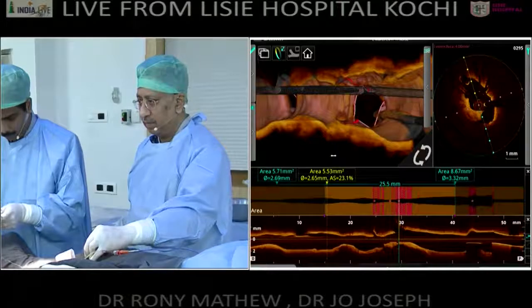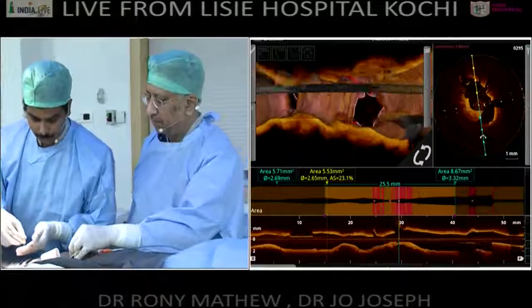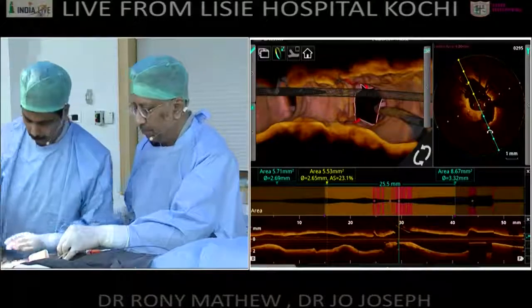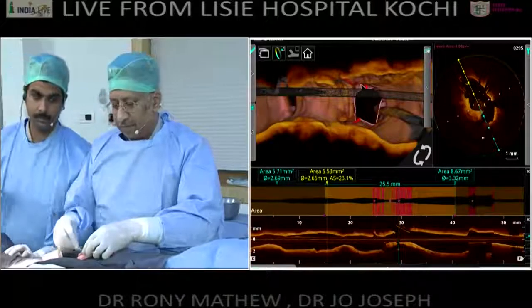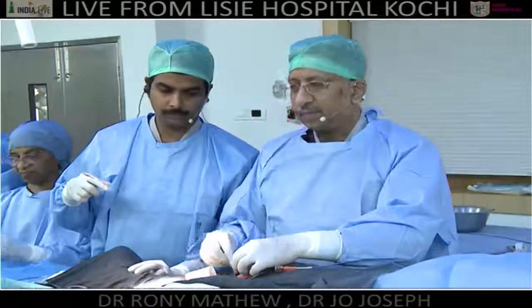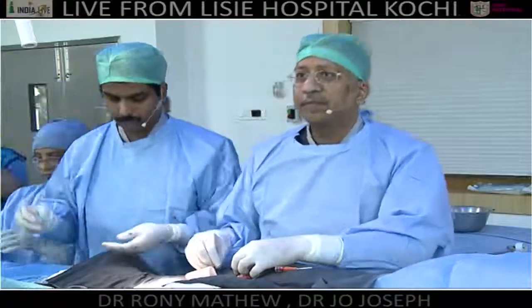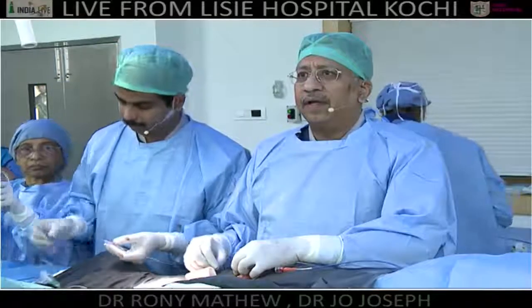Rony, I just have one question. You must have been doing these kinds of techniques before without OCT. Has this OCT really helped you? I know that crossing of that strut you showed very elegantly, but has it helped in your strategy in any way, or is it just part of the imaging process that we want to carry out?